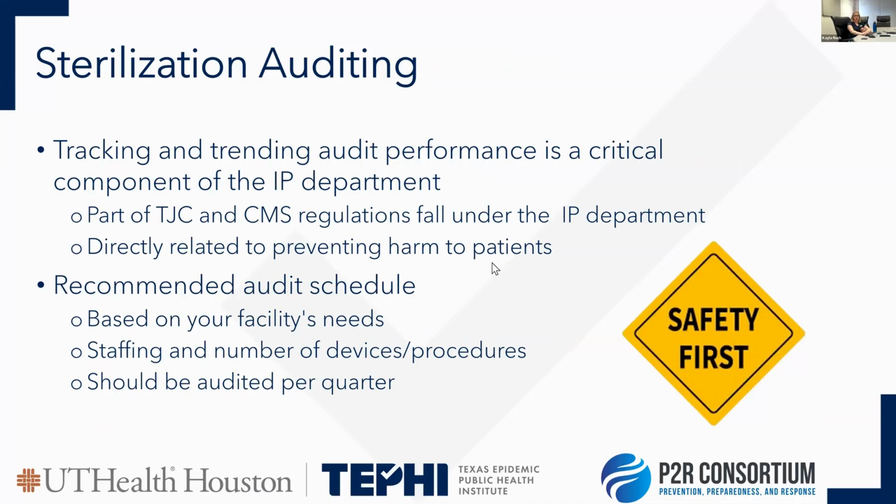It's really important that you audit and monitor this, because there are high risk consequences if things break down in the sterilization process. Essentially, it's going to be harm to our patients by potentially exposing them to a device that has not been sterilized. So you want to make sure that you have a plan at your organization for how often you are monitoring it. It should be monitored regularly, depending on your staff flow and how many pieces of equipment you're using at your organization. That will also affect how often you should monitor it, and if anything needs to be going on.